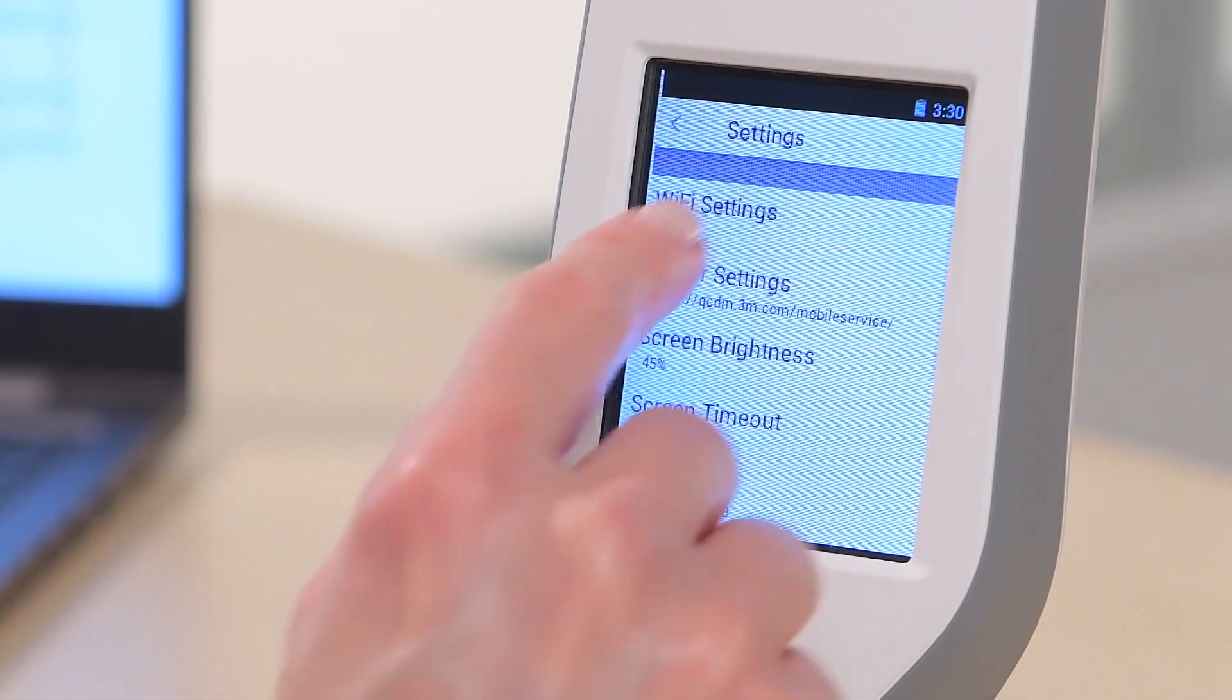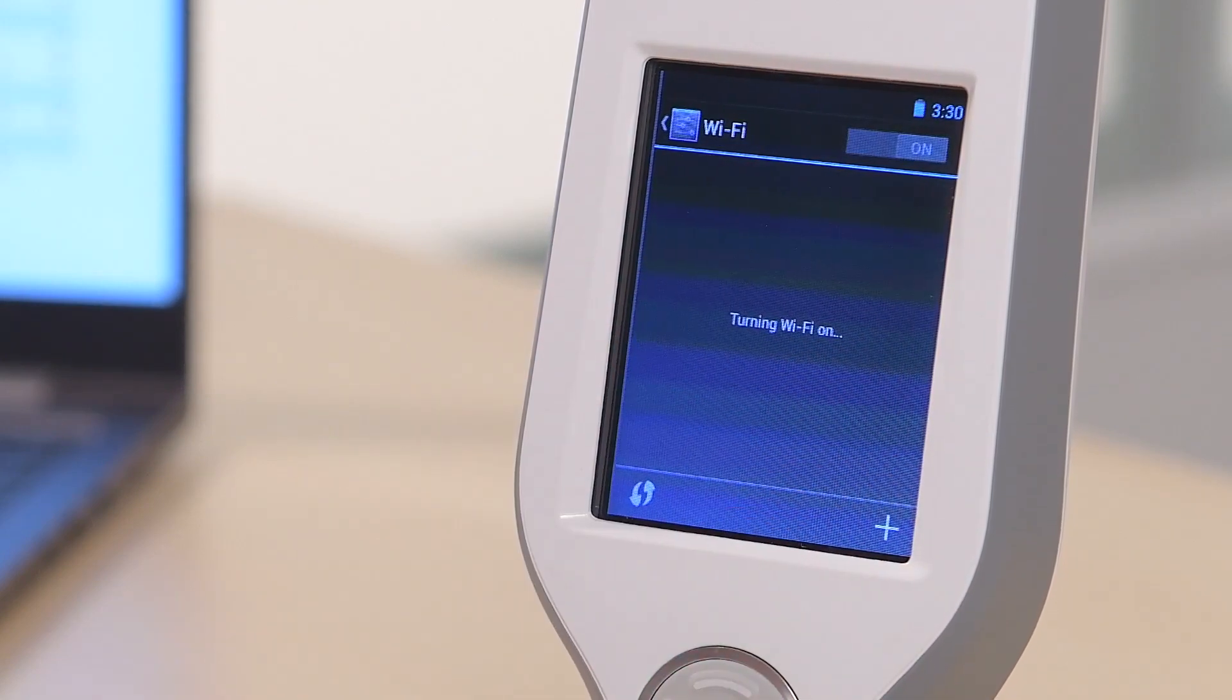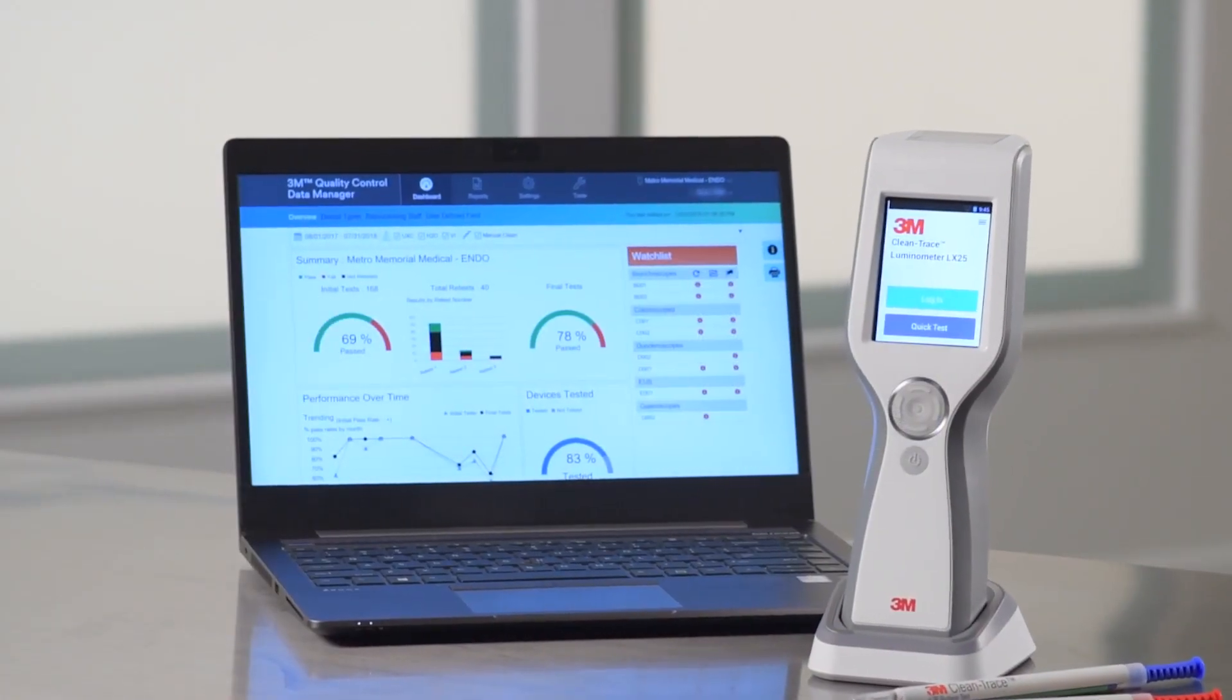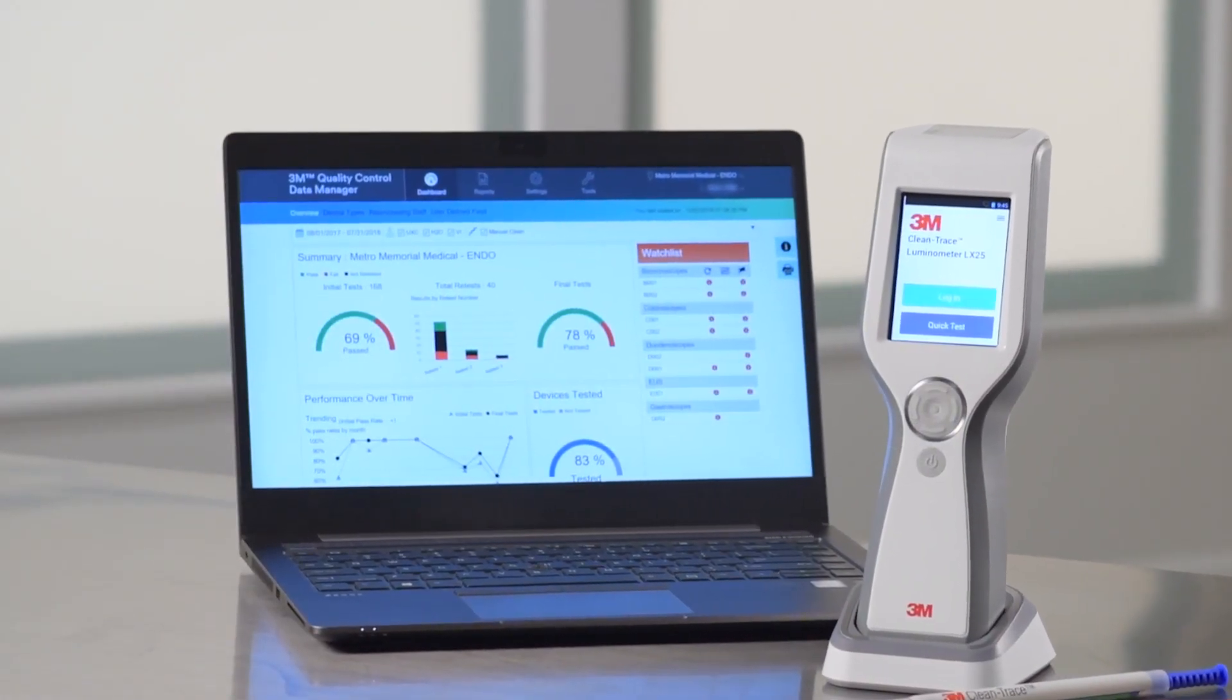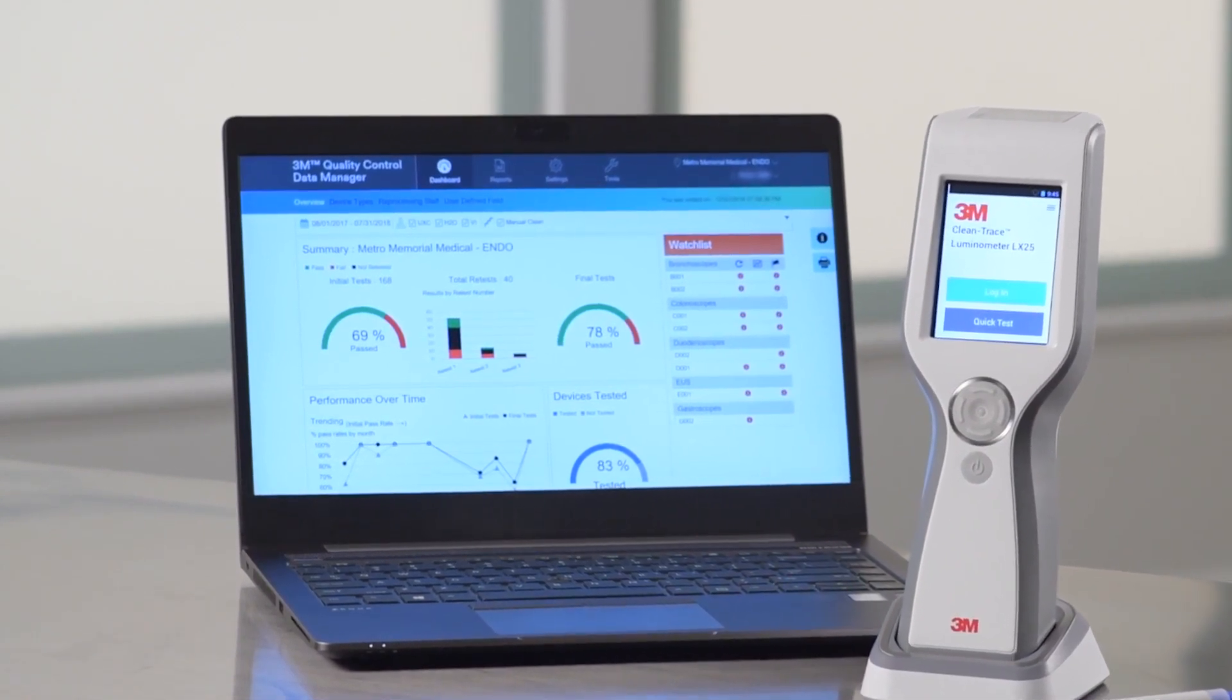When connected to Wi-Fi, your result will be transmitted wirelessly from the Luminometer to the 3M Quality Control Data Manager. This online hosted service allows you to identify weak spots, problem areas and trends, improving and streamlining your entire cleaning process.